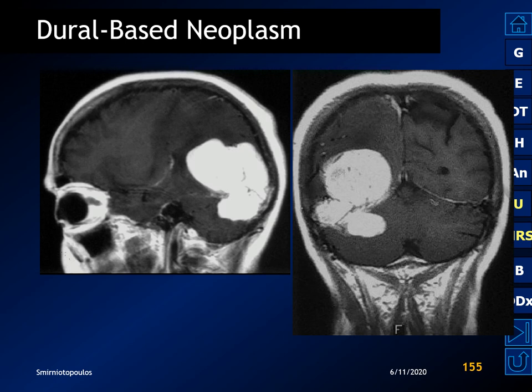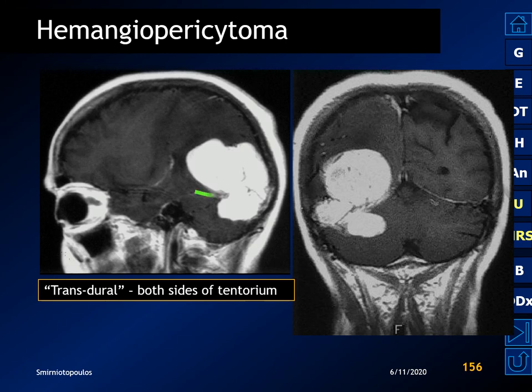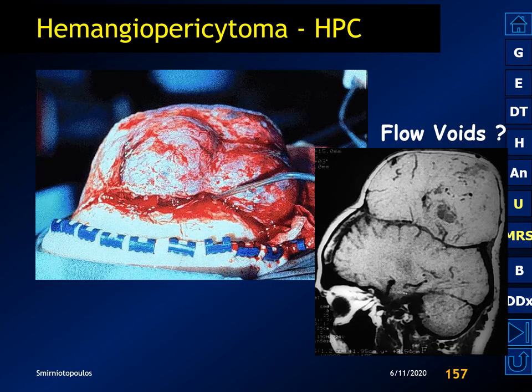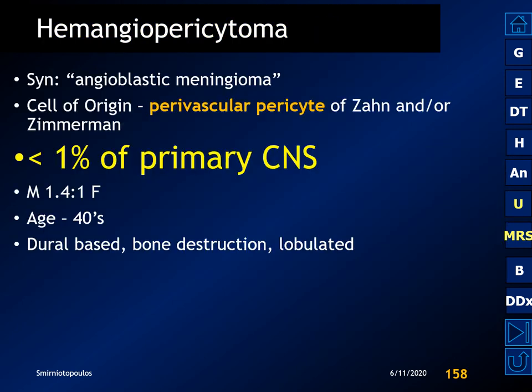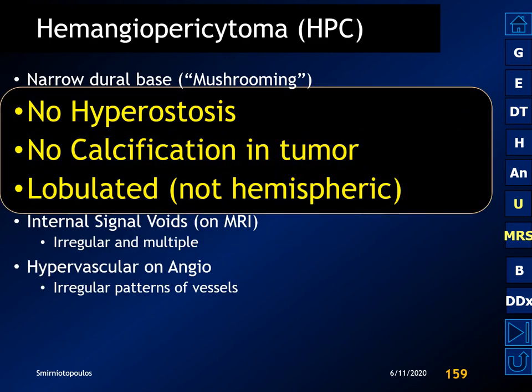Here we have a dural-based tumor that instead of being hemispheric shows a very lobulated configuration. Both meningiomas and hemangiopericytomas can be transdural, appearing on both sides of the falx or the tentorium. Here is another example of a hemangiopericytoma — an enormous, very lobulated mass with multiple irregular flow voids. Hemangiopericytomas represent a couple percent of dural-based tumors and have a slight male predilection. They never have hyperostosis, and we never see calcification or psammoma bodies within the tumor.